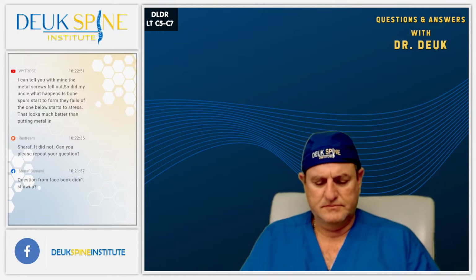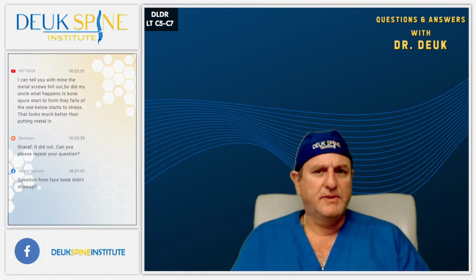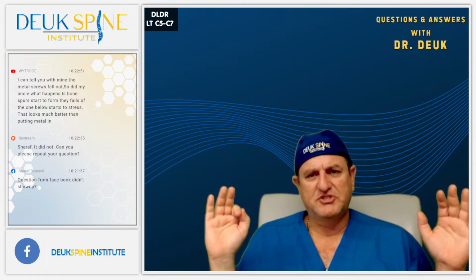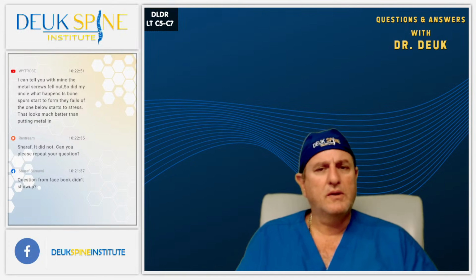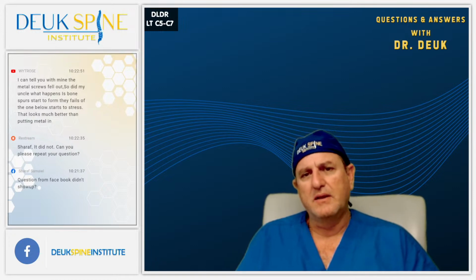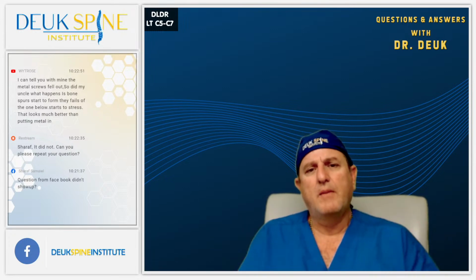And a follow-up question from Rose, I believe they're asking, how do you numb? I believe that's before the procedure starts. How do you numb patients before insertion? How do you numb the patients? Well, great question. This one surgery we just completed, the patient was actually asleep. We had the tube down, they were on gas anesthesia, they were knocked out, completely out. Therefore, numbing them is not as important, but if you go back and watch, I actually put some numbing medicine in the skin before we cut it. So that will numb the pain nerves so that they don't get a subconscious pain response with elevated blood pressure or heart rate.